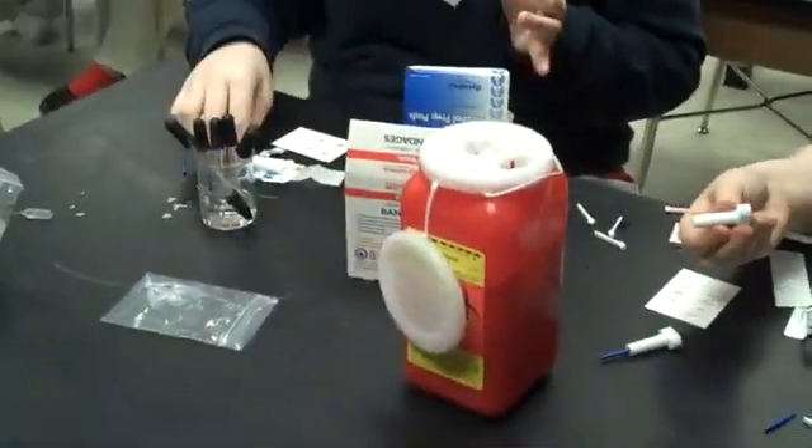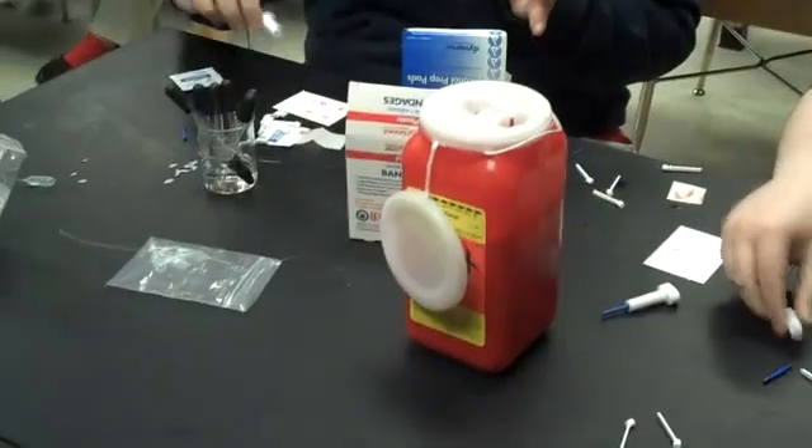Now we want to give you the band-aids and get another alcohol pad for the first aid part. Let's show the safety — we want to put any sharps in the biohazard container. Just throw the whole thing away in the biohazard container.